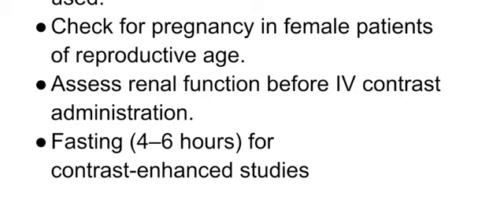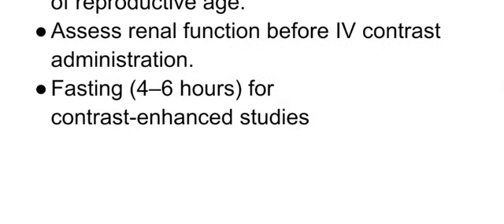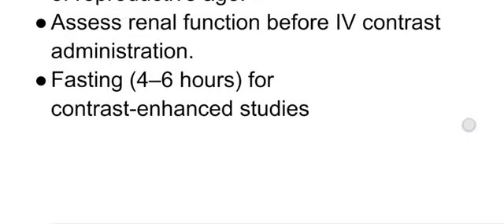And you have to assess the renal function before the IV contrast administration. That is about the kidney's condition. We have to know whether the kidney has the ability to eliminate the contrast from the patient's body after the examination. So we have to check whether the renal function is good or not. And it is compulsory to maintain a fasting of 4 to 6 hours before the examination, mostly in the case of contrast enhanced studies, as fasting can improve the imaging quality and help us to provide a detailed structure of the internal organs.